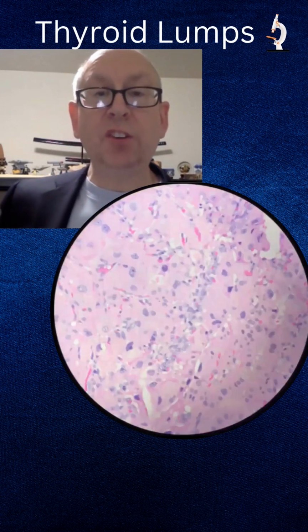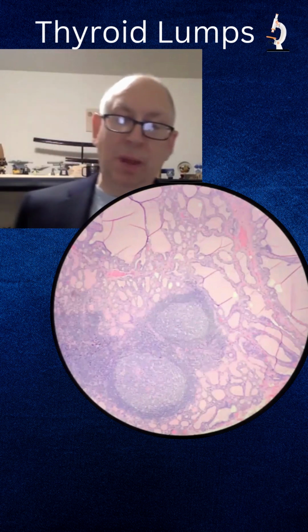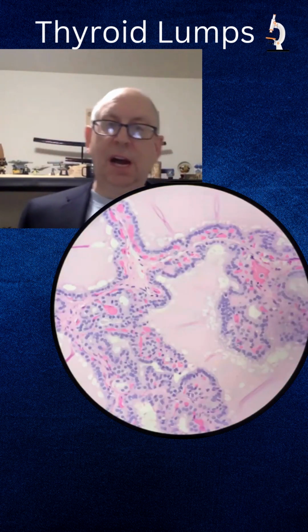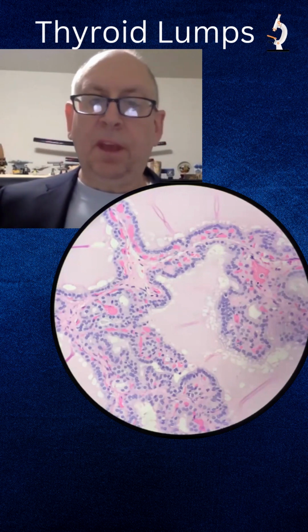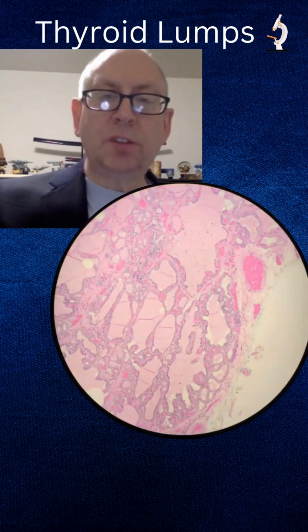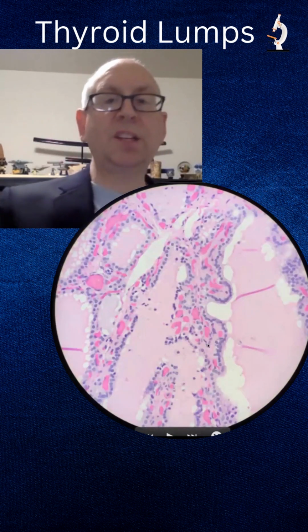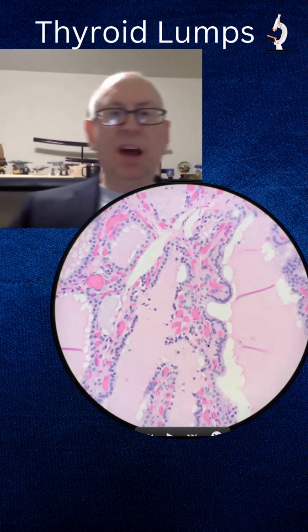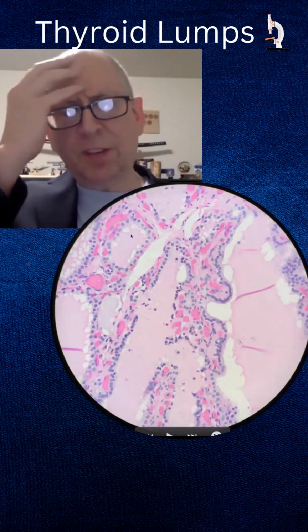So I'm in a challenge zone here because I have structurally papillary structures. I have nuclear, not papillary. And then I have other areas with the same kind of papillary structures, but I don't have the nuclear features. And notice I've also got some sort of active secretion or resorption of the colloid. Okay, so what's the mystery I have to solve here?